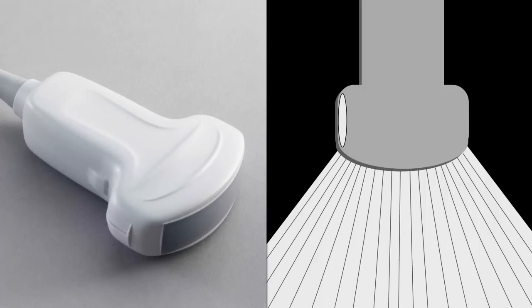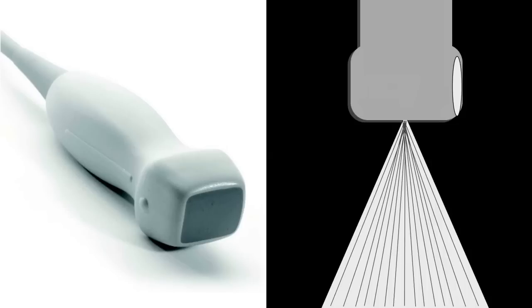Compare that to a curved array, which takes the linear array format and bends it into a curve. This allows you a wider field of view, but you can see that the sound waves start to splay out as they travel further from the probe, meaning that very near to the probe, the sound waves are close together, giving you a nice lateral resolution, but further away and deeper into the structure, they're further apart and give you less resolution. The phased array starts from a very narrow point and splays very widely. This gives you the worst resolution out of all three types of probes. However, this also gives you the smallest footprint in order to image through a very narrow space. And that's why this is used as a cardiac probe for echocardiography, because you can get in between the ribs and in between lung spaces to try and get to the heart.